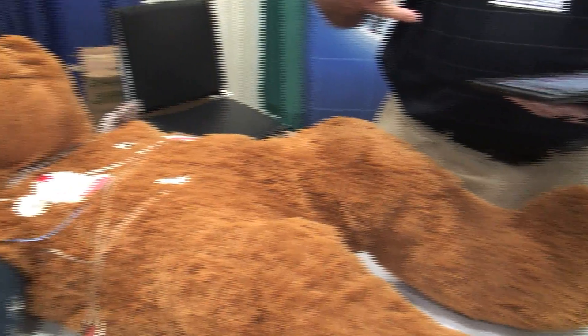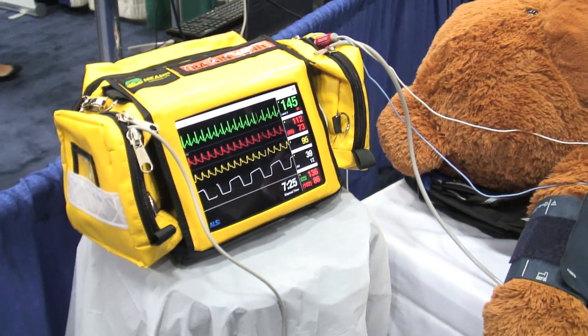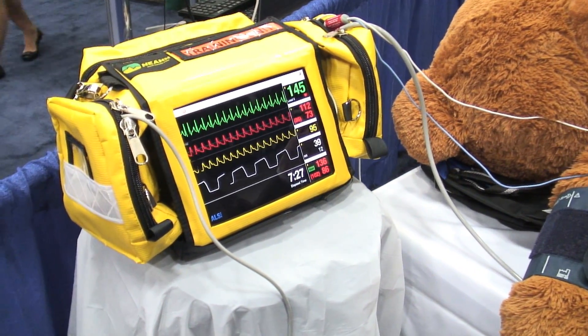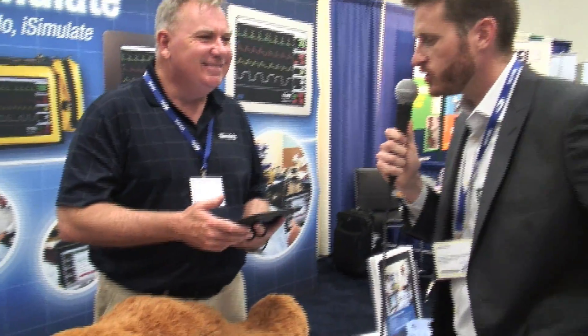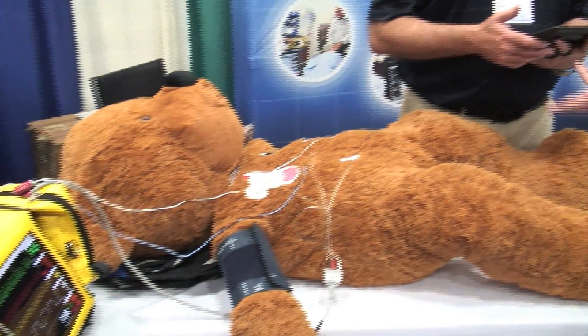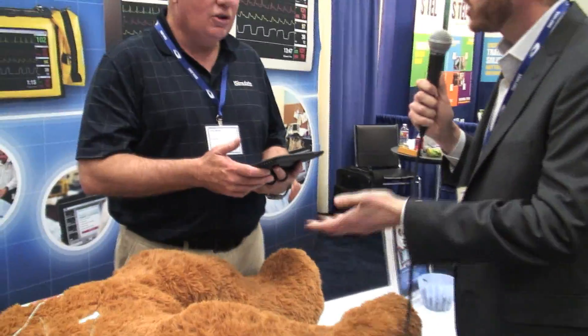Without the cost and expense of monitors and mannequins, you can do simulated patients, live patient simulators, or add it to a low-fidelity mannequin and increase your fidelity. A low-fidelity mannequin could be utilized in such a way that we could have high-fidelity presentations with just the simple additional cost of two iPads and the iSimulate system.